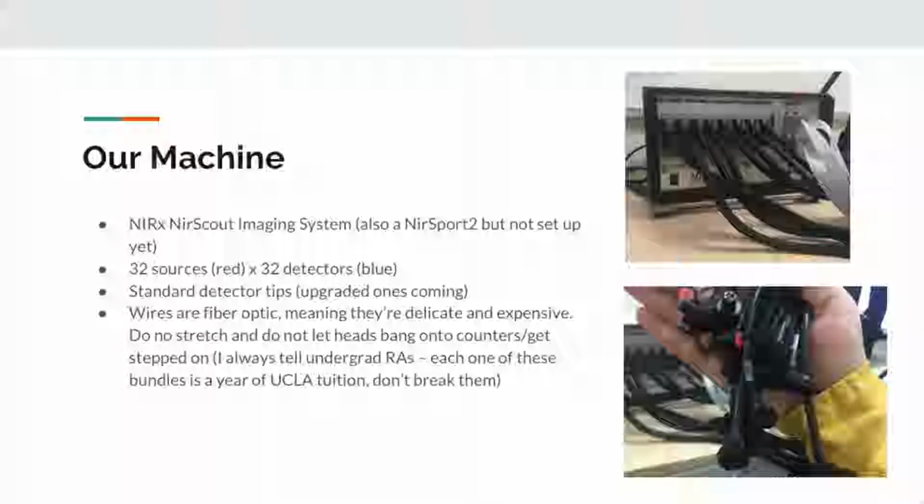The wires are fiber optic, meaning they're delicate and expensive. Do not stretch them. Do not let the heads bang on the counters when you're unpacking things, and don't let them be hanging on the floor where they can get stepped on. I always tell the undergrad RAs when I'm training them, each one of these bundles is a year's tuition at UCLA. So unless you're ready to pay for that, don't break things.